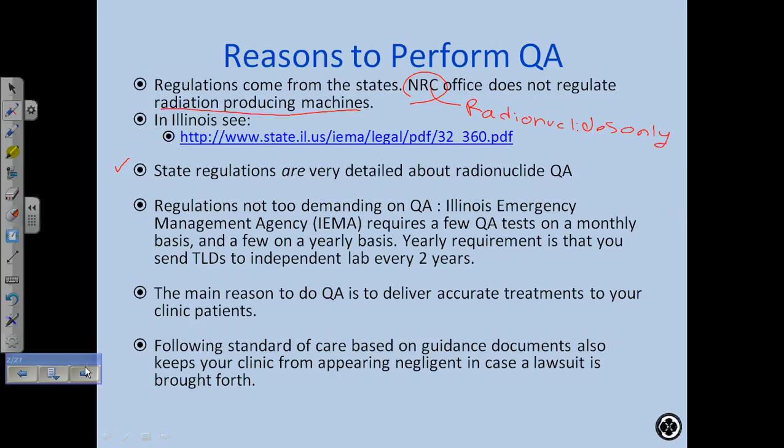Okay. So the main reason to do QA is to deliver accurate treatments to your clinic patients, and following standard of care based on guidance documents also keeps your clinic from appearing negligent in case a lawsuit is brought forth.